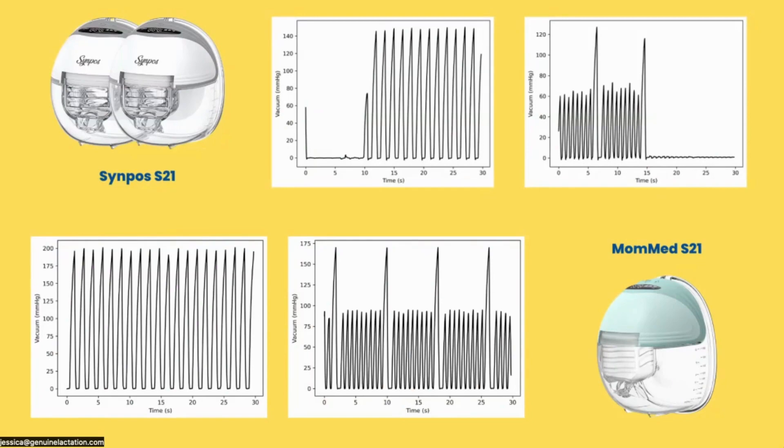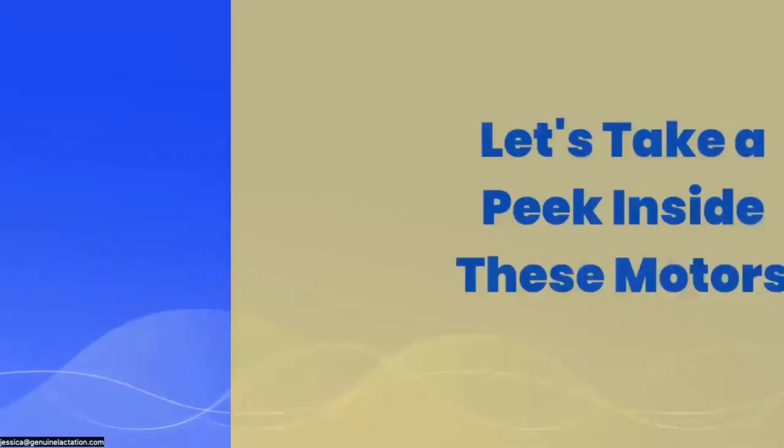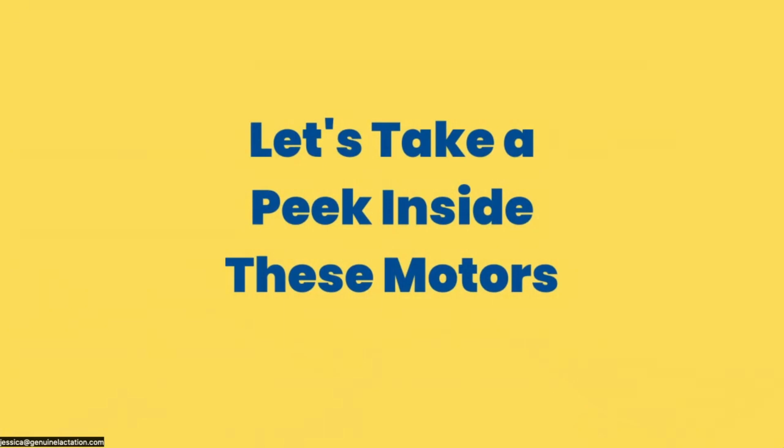The MomMed was a really surprising little find in terms of how it was testing. So these pumps look the same — they're marketed as both being S21s — but they're not performing quite the same. So what I did is I had my husband open them up and give me his perspective on the motors as an engineer, to help me get a better idea of why these pumps are not performing the same. Let's take a peek inside these motors.